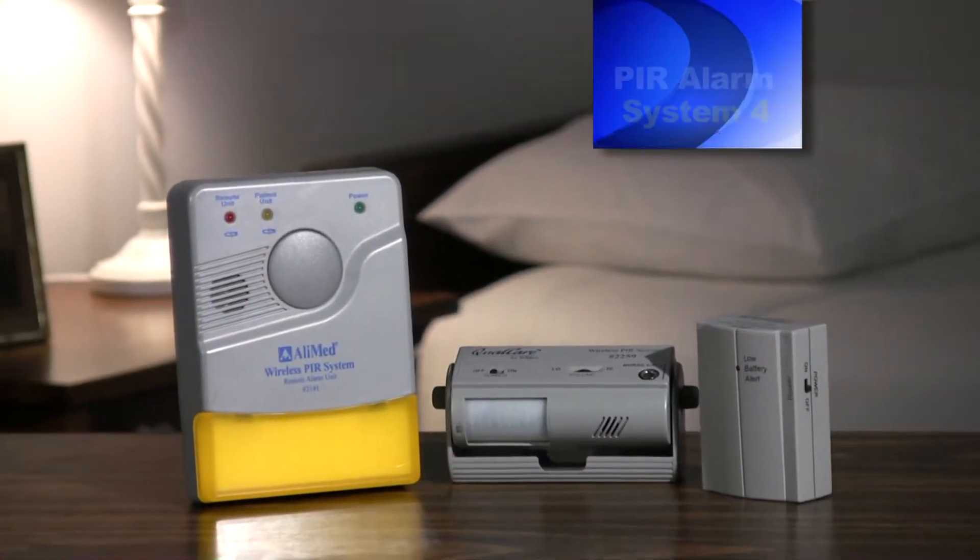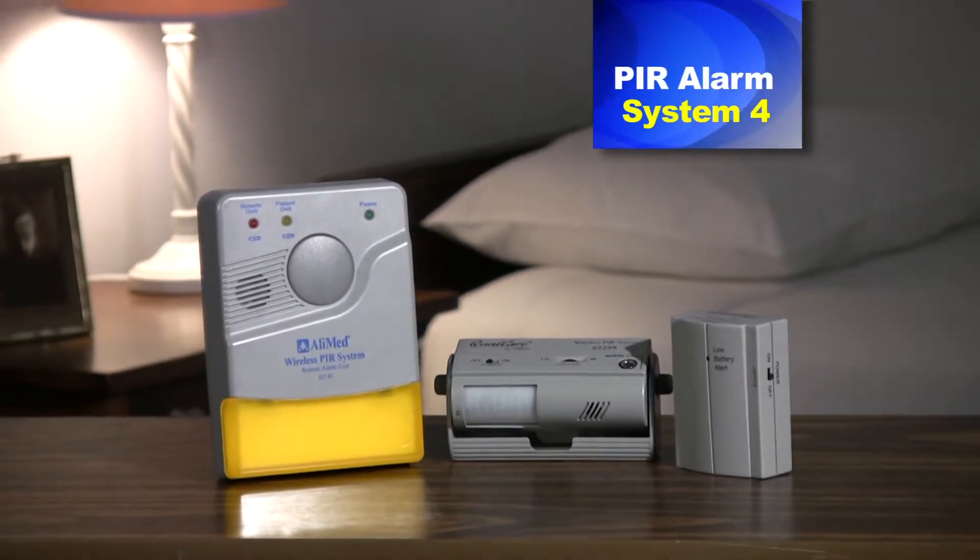Hello, I'm Heidi Young from Alimed and you are viewing video 4 of the PIR alarm systems featuring System 4, motion detection bed alarm with remote receiver and nurse call receiver. If you have not yet seen our overview, you may want to go back and view that video first to get a general idea of how the system as a whole works, how to use it, and all its benefits and features.